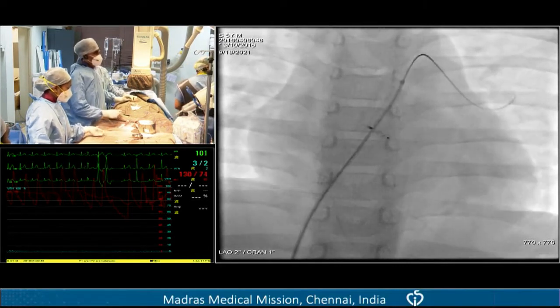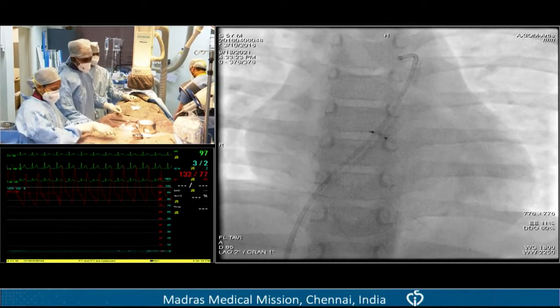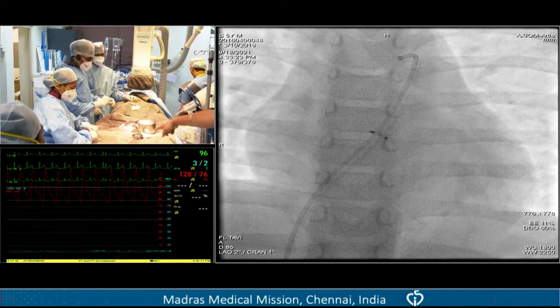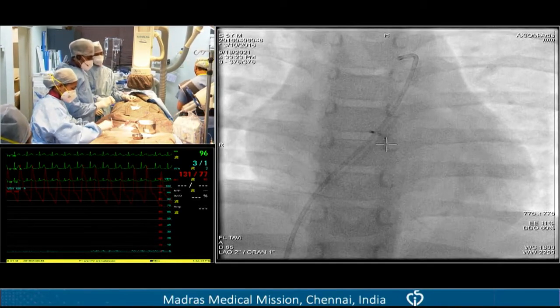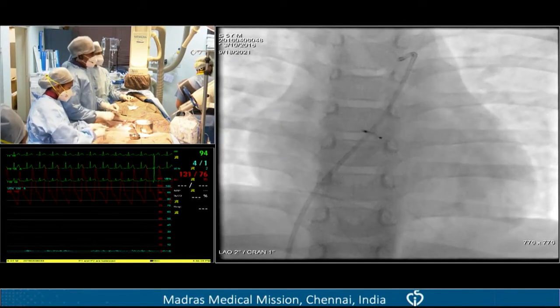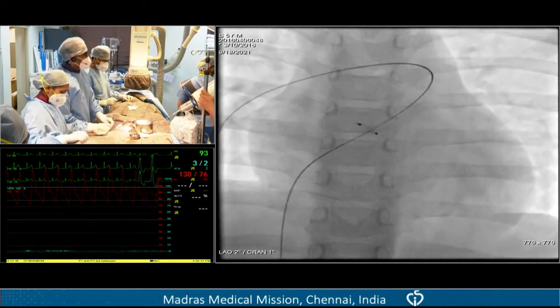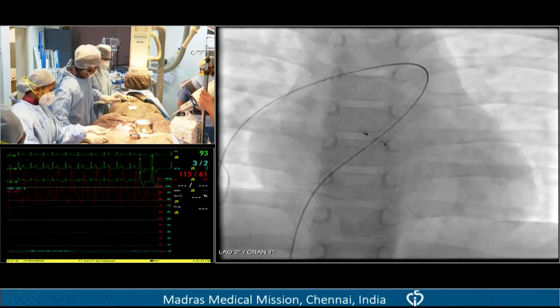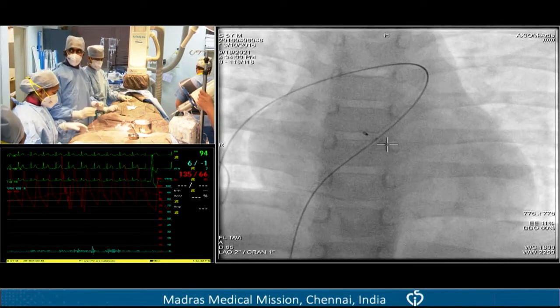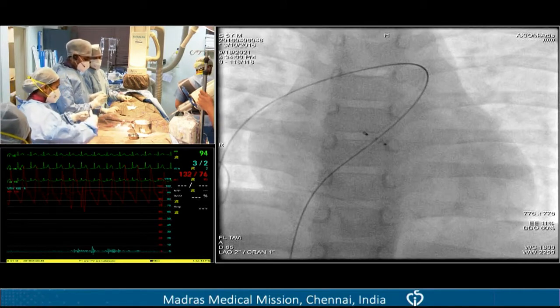All right. We will get you once again to MMM and have a Neil Wilson. Right. Shiva, okay, 30 seconds. Pigtail. Get the injector ready. So you're going to do a PA angio and follow it through, are you? Yeah, that's it. Shaq is more cruel than Inga. Well, we're 5 minutes into Horst's case now. I feel sorry about it. Yeah, I know that. You sound very, very sorry.